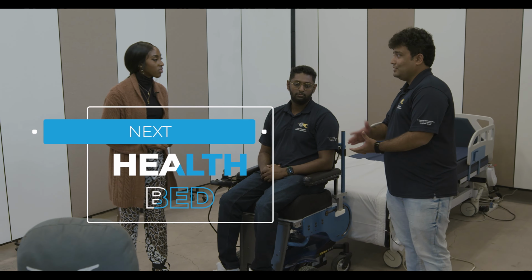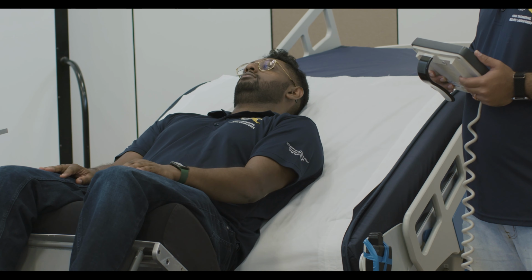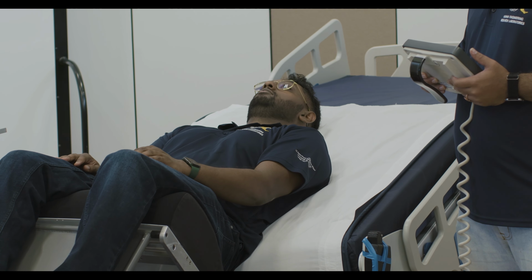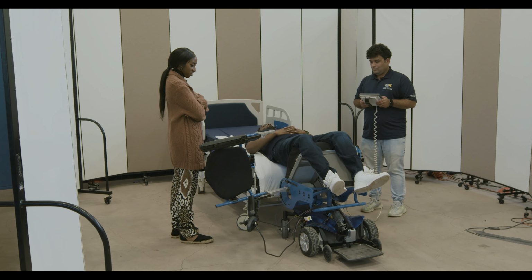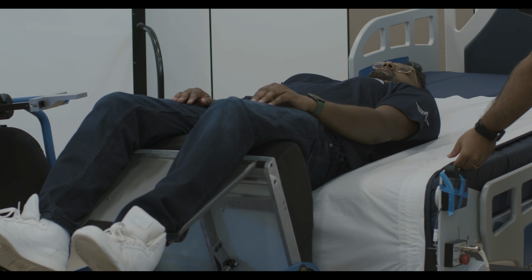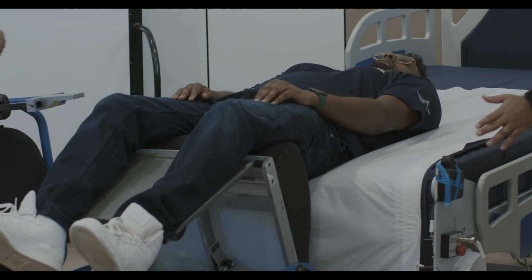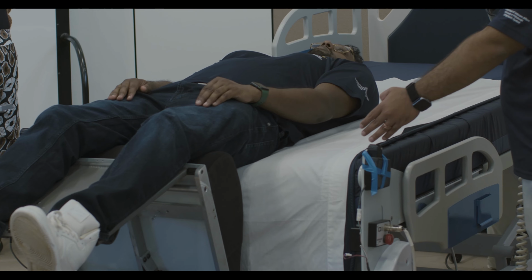What we have here is called the powered personal transfer system. Oh, so it's basically a robotic transfer system, and it provides a no-lift solution. Caregivers are susceptible to injury. Yeah, both my parents are nurses, actually at the VA. We've seen some back injuries. So it makes it safer for the caregiver and also for the care recipient. This bed is equipped with a conveyor system. Once he's fully into the bed, infrared sensors detect that his feet have crossed.